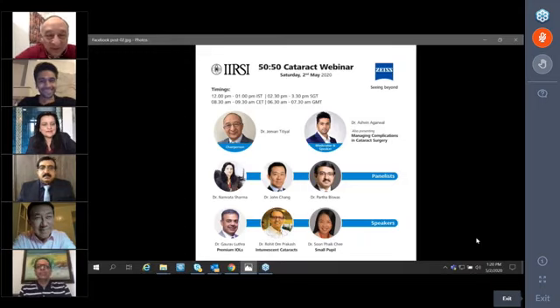I'll take it. If somebody is above 70 and doesn't have posterior segment problems like macular degeneration or a scar or diabetic changes or long-standing glaucoma, and they have a normal anatomy, yes, they are the people who will benefit best. In fact, I'll go for a higher add for these people because they'll be doing more reading and near work. Maybe I can go bifocal and give them a +3, +4 add. If they have a golfing type of attitude, then maybe trifocal for these patients. But I think the posterior segment assessment and the other features need to be checked for older patients.